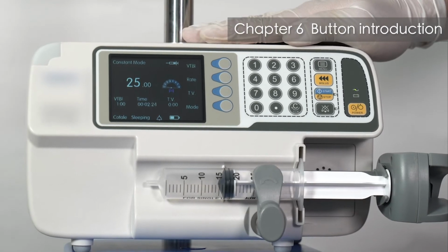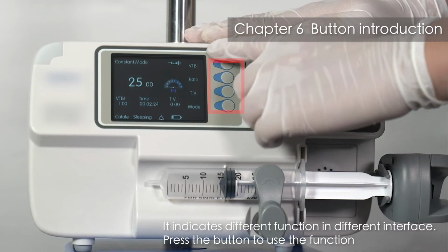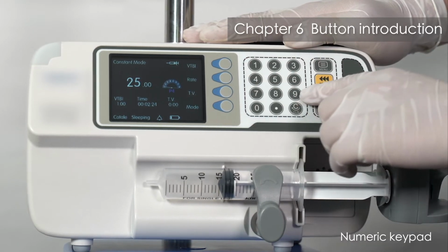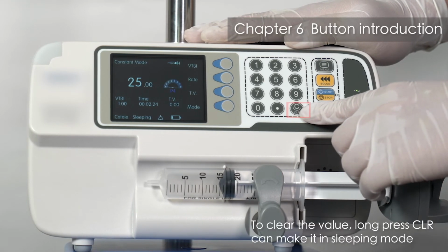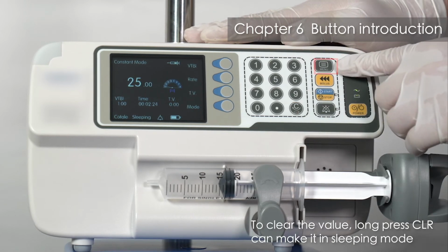Chapter 6. Button Introduction. Function button. It indicates different function in different interface. Press the button to use the function. Numeric keypad. To input the data for different function. CLR button. To clear the value. Long press CLR can make it in sleeping mode.